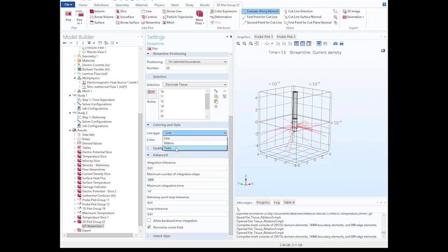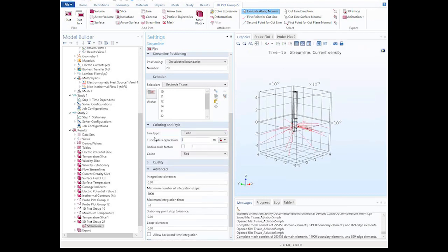To make it look more beautiful, I like to say, let's say 0.5 millimeter radius, and plot again. Oops, too much. 0.1.